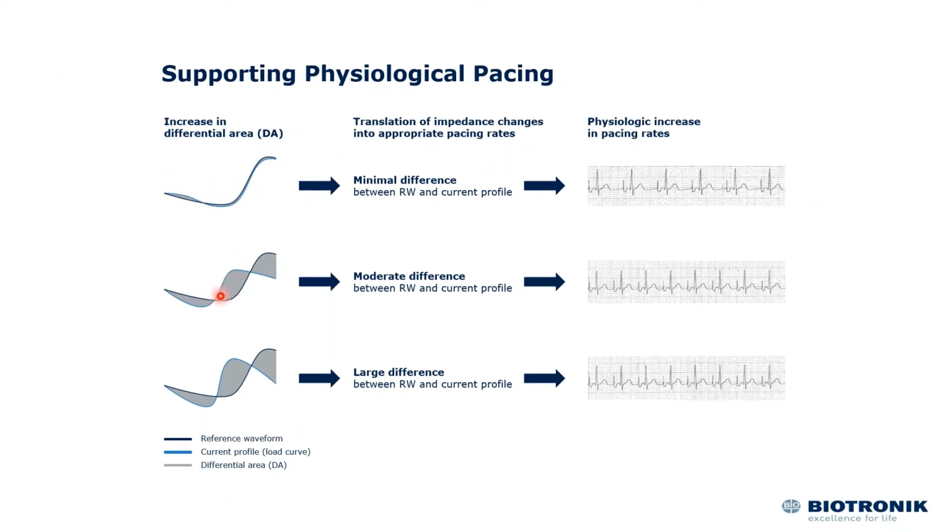Whenever it begins to sense more changes in the impedance, it will compare the baseline graph that has been plotted all the time with the increment of the contractility graph. Then if there are more and more differences, the pacing rate will be adjusted based on the patient's indication.